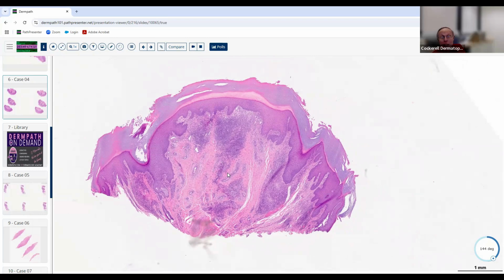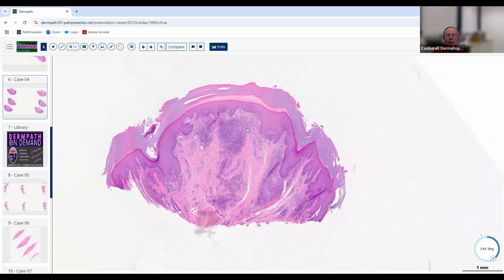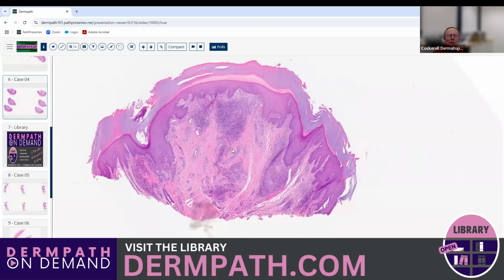You said itchy, they got EOs, right? So maybe that's why it's got this markedly thickened cornified layer. If they're picking at it, saying, hey, wow, there are EOs in here, they start scratching and boom, they get marked lichen simplex chronicus. It kind of makes it look like a wart, and it's really not that. So that may be why it looks like volar skin, but it's really not. And they usually are seen on the head and neck area, often around the ear. This could be the ear, very could be that location. So that's good. And they're usually fairly bright red when you see them, or purple. They look like an angioma when you see them clinically.